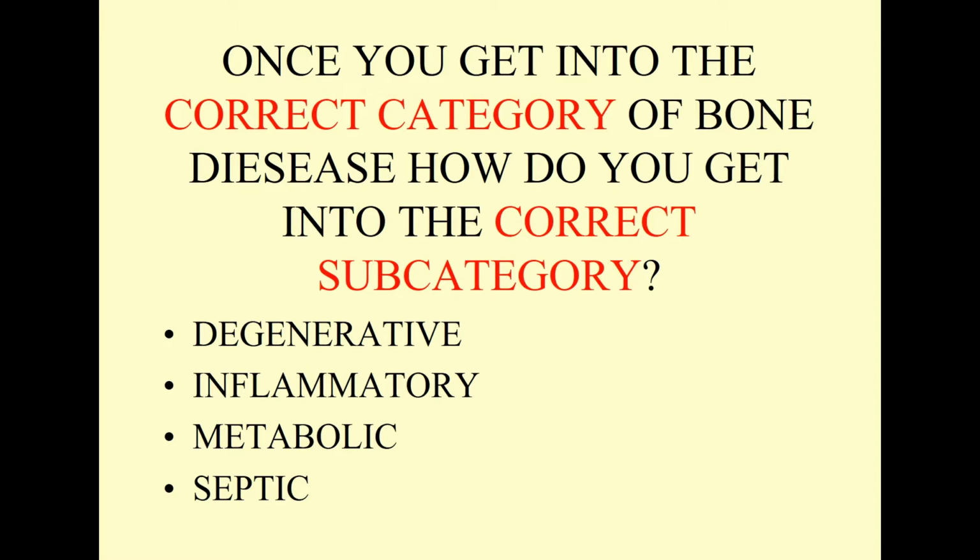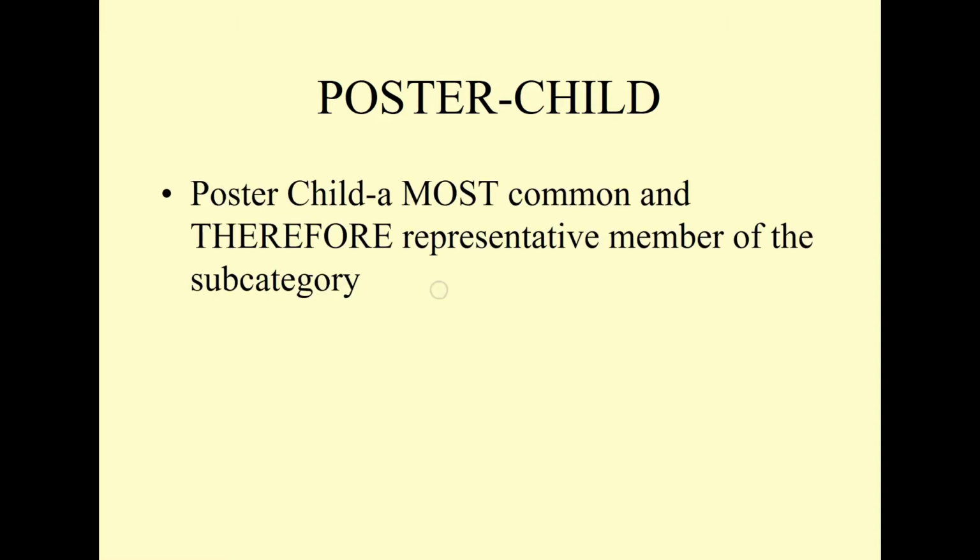With a good job doing your ABCs for interpretation, harvesting good information, and coupling that with what you learn about the patient, more often than not we can successfully get into the correct subcategory of arthritis. If we do what I call poster child thinking, so if we did a retrospective study, took 1,000 patients with confirmed degenerative joint disease of some kind, recruited the first 1,000 people that fit that criteria, and then started looking at what form of degenerative arthritis they have, whatever entity comes out with the most number of cases is who we determine to be our poster child. That's a critically important decision to make, and will allow us to get into the right subcategory much more quickly. Then the information we find will have to either stand or fall on its own, and we can sometimes have to turn our back on the poster child and deal with a less common member of the group.